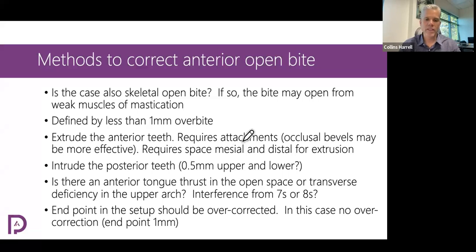And if there are bevels on the attachments, it may be more effective to have those bevels facing the gingival, so that we have more surface area on the gingival surface to push on. Okay, and we have to have space available for the extrusion.